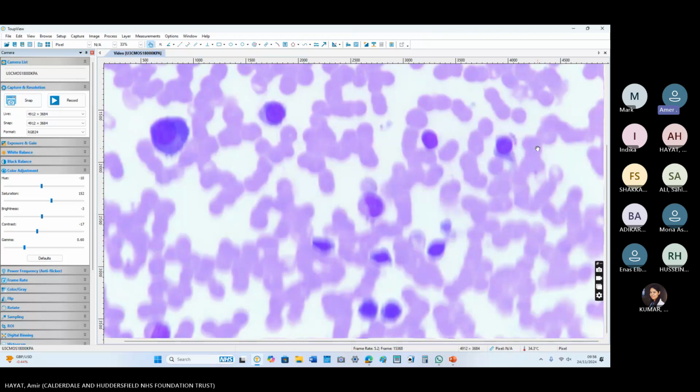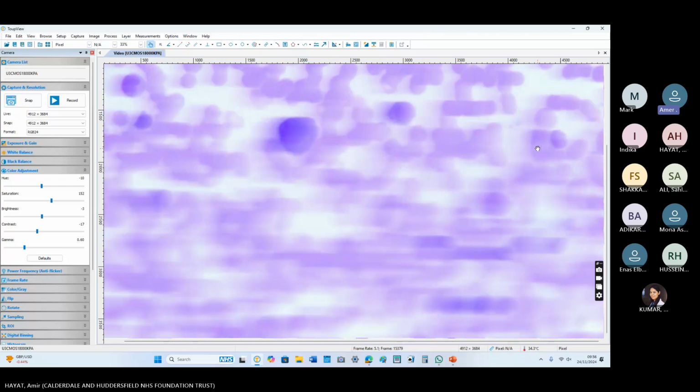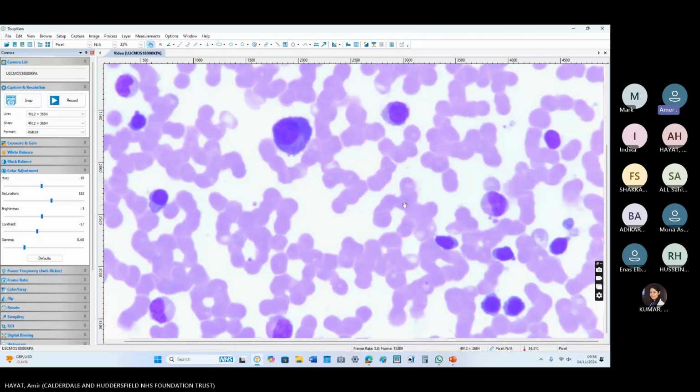Sorry, I don't have the trephine of this patient, because bringing out trephine is a bit difficult because of legal purposes. Aspirate, we can stain aspirate cells in the laboratory. We bring out aspirate. This is a giant plasma cell with some projection, eccentric nucleus with halo and projection.